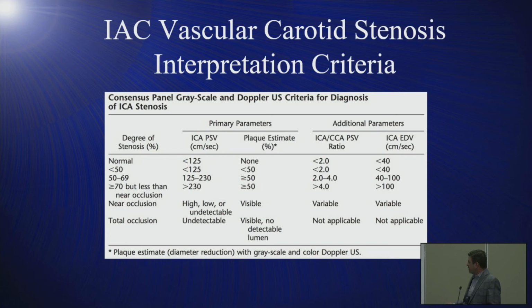And so, over 70, we want greater than 230 systolic, we want over 100 diastolic, ratio of 4, and our lab's fairly consistent with that. I think most labs should start to move towards that direction to get some interoperable connections between, communications about what carotid disease is and how to interpret the level of disease for these patients.